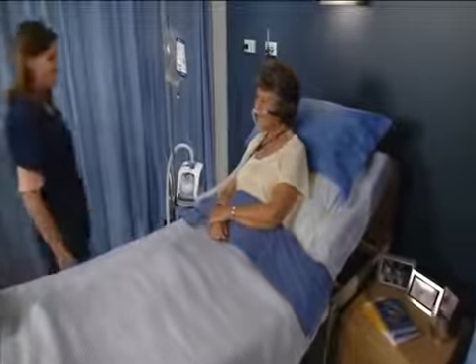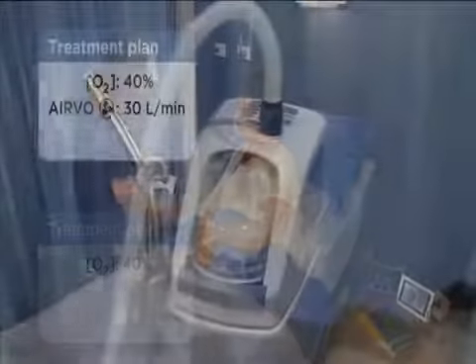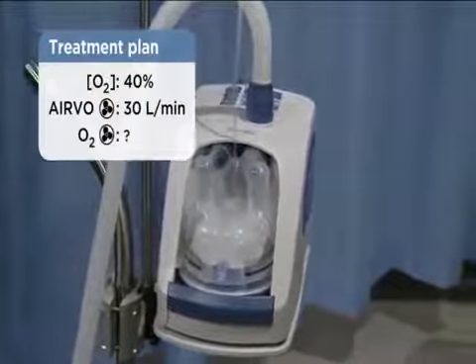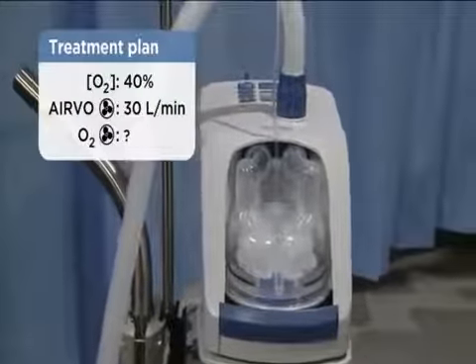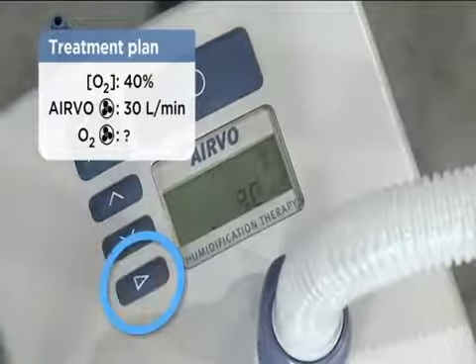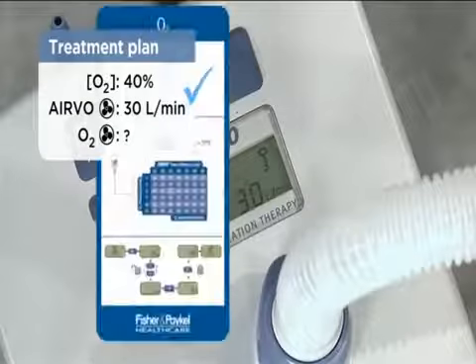This patient requires an oxygen concentration of 40% and an Airvo flow rate of 30 litres per minute. We can determine the wall oxygen flow rate she will need by using the oxygen chart. First, check the Airvo flow setting by pressing the Mode button. In this case, it is correct. If not correct, refer to the swing tag to change it.